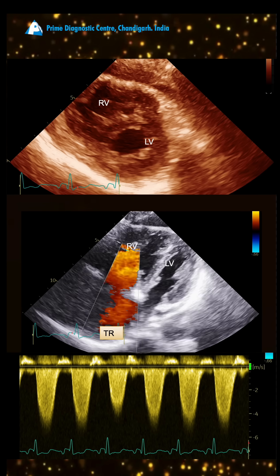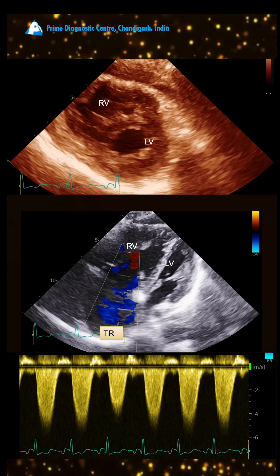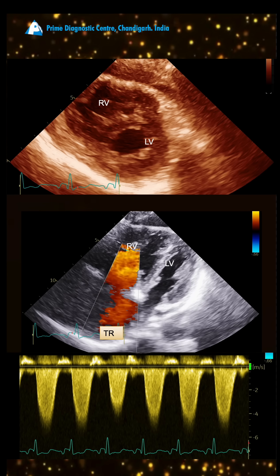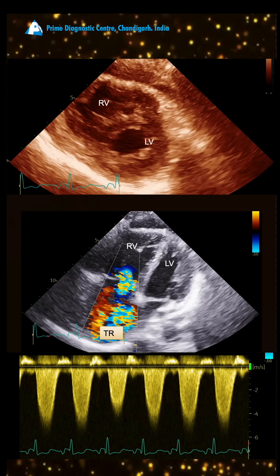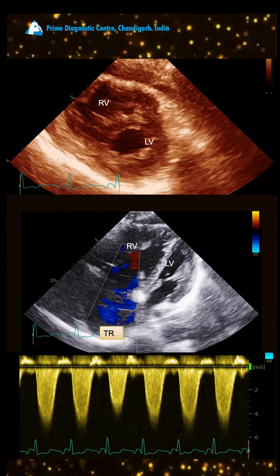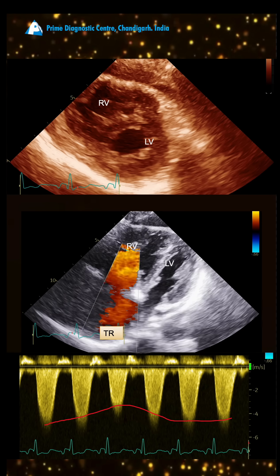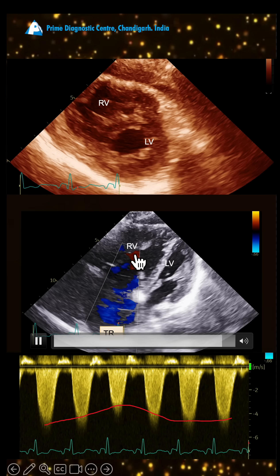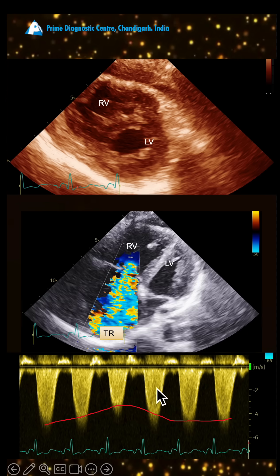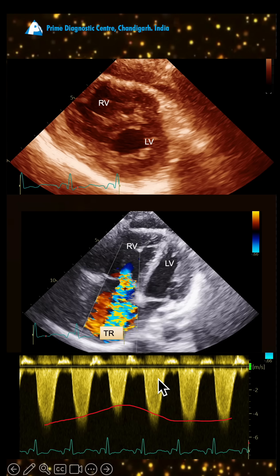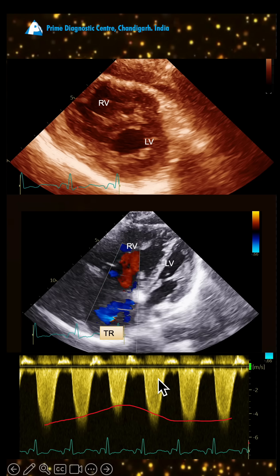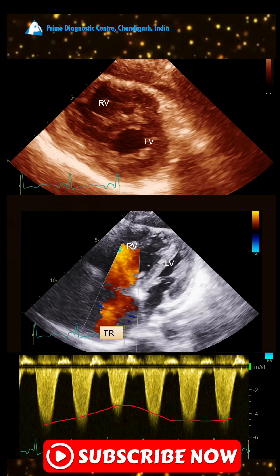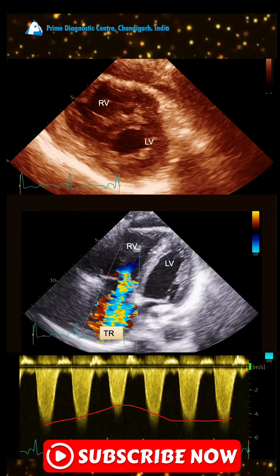The volume overload is confirmed by severe tricuspid regurgitation. The severity is demonstrated by CW Doppler, which shows variability and a dense TR jet.